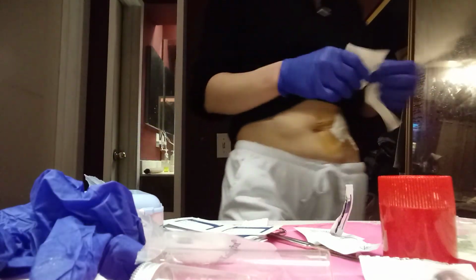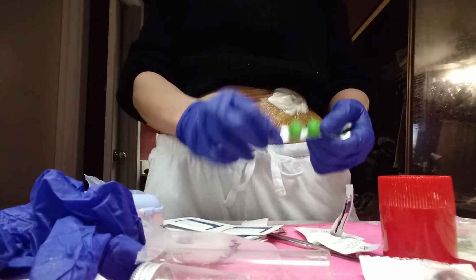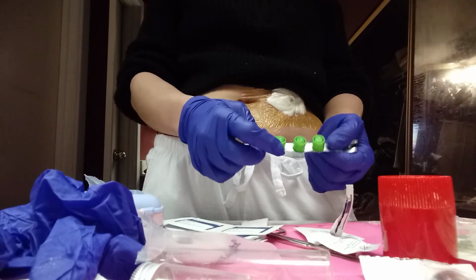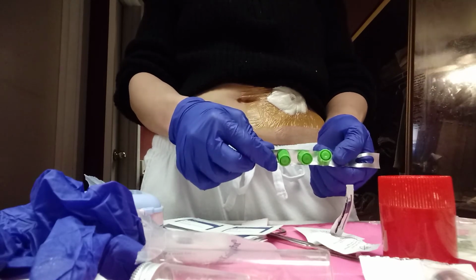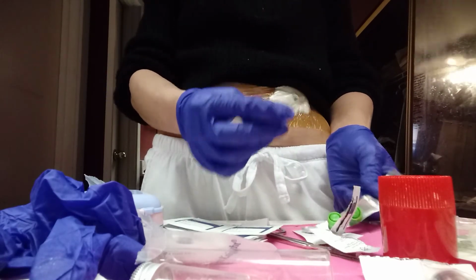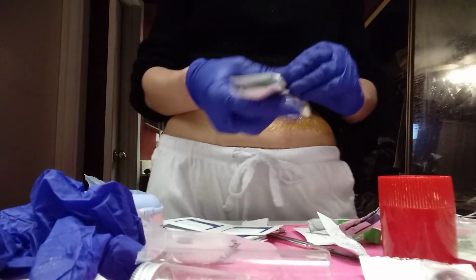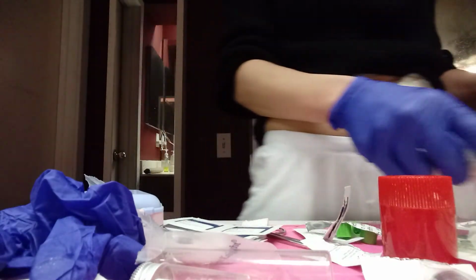All right, the second thing is bring some caps with you. You can get them from your hospital. The thing that keeps the germs out are these caps that go on the end of your PICC line so that it doesn't get infected. If one of these falls off, just put one immediately on and call your nurse or your doctor. Okay? The next thing that I carry with me is betadine and iodine. I'm allergic to ChloraPrep, so if I had to do a new dressing, I have that with me.